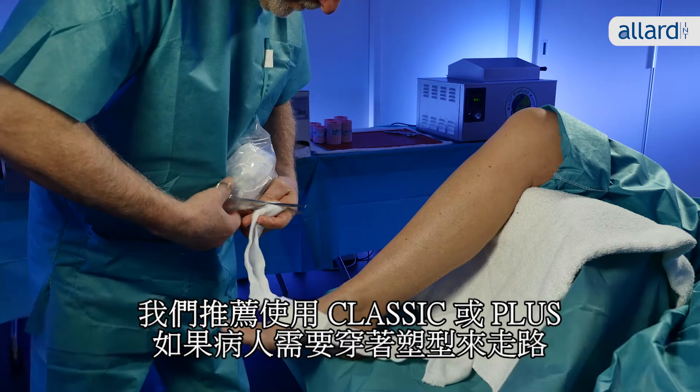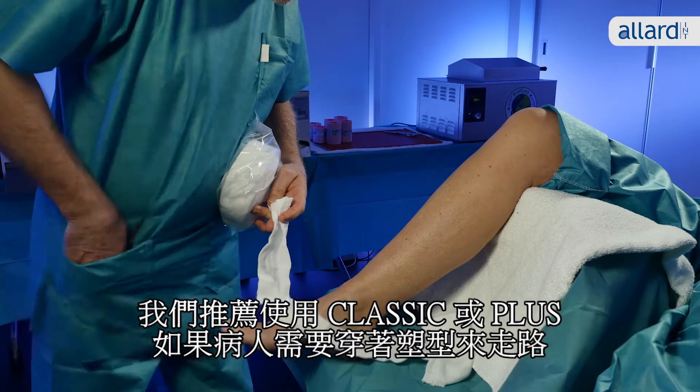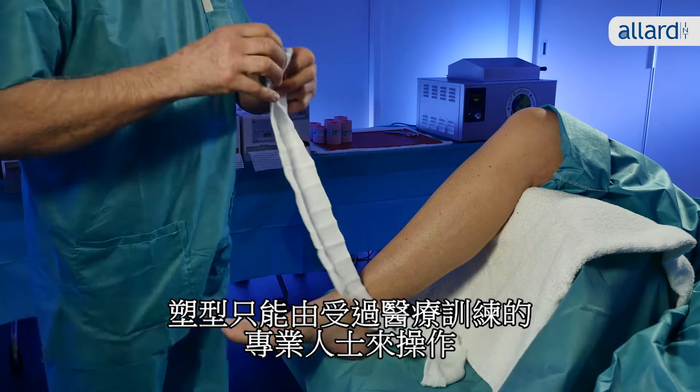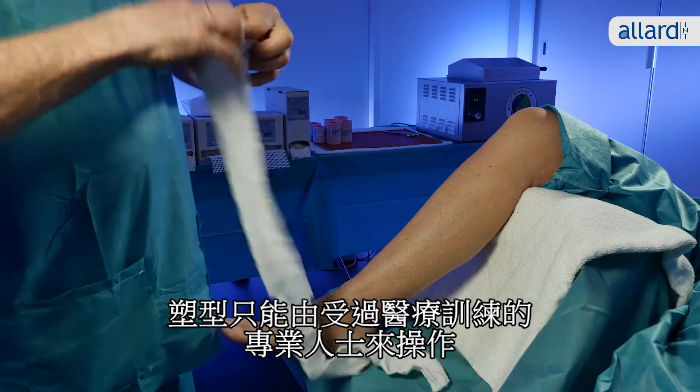However, we recommend Classic or Plus if the patient needs to walk with the cast on. The cast should only be applied by professional medically trained persons.